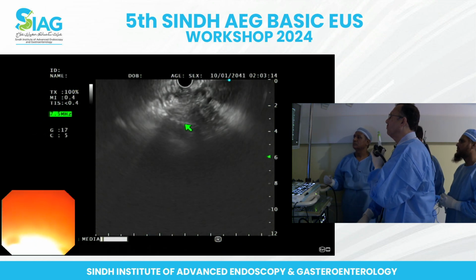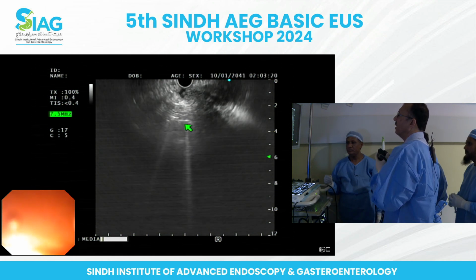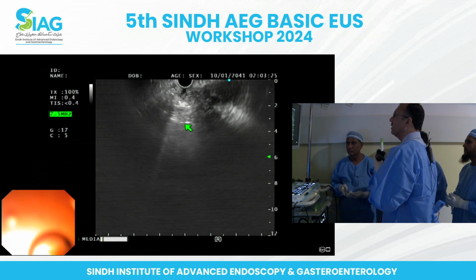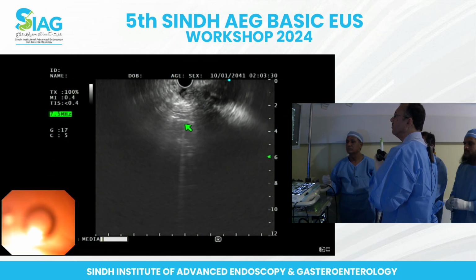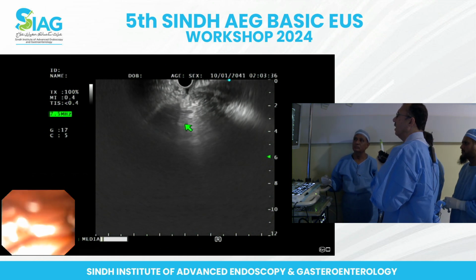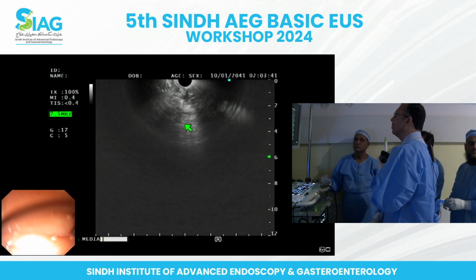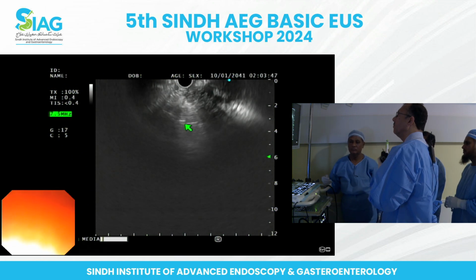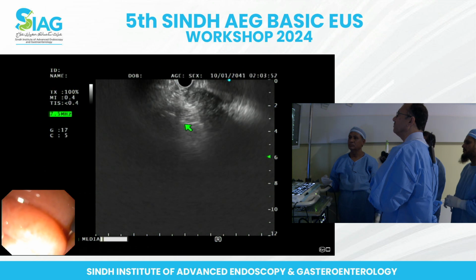Would you categorize this as a sinister lesion or just an inflammatory pseudomass? I shall put it down as an inflammatory lesion, not the malignant lesion, because the lymph nodes are not of that nature. With the presence of stent, I don't know whether it's a stent reaction or something different. I'm not very sure about the nature of this lesion. This is not clear-cut malignant in nature. That's what I'm sure about. Dr. Gyas, how does the ampulla look endoscopically? It's fine. It's fine.